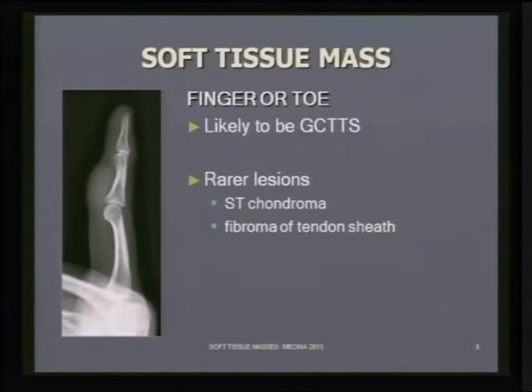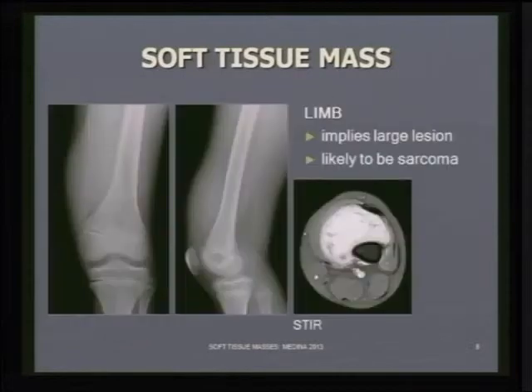But also remember that, as I've mentioned, cystic lesions cannot be differentiated from solid lesions. So certainly those lesions related to the tendons may in fact be small ganglion cysts, and that can be assessed further with ultrasound or MRI, as I've already mentioned.